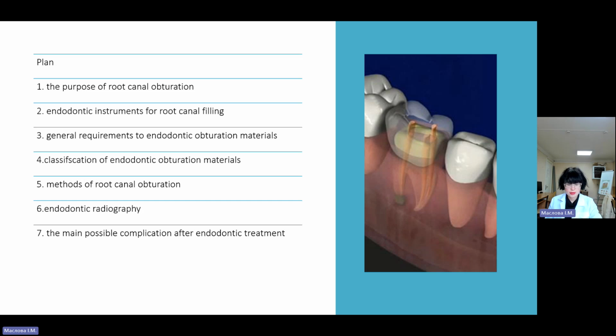Entombing the bacteria within the root canal system should result in all remaining bacteria being sealed by the root canal filling in dentinal tubules, lateral canals, apical ramifications, and isthmuses, to prevent their communication with the periradicular tissue. Root fillings consisting of gutta-percha cones as a core material combined with root canal sealer have been standard practice for many years.